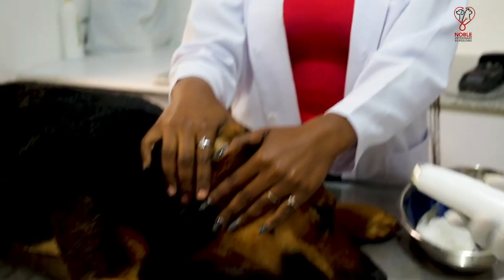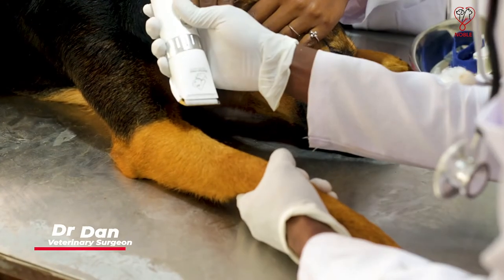The first procedure that we do is shaving the site before we start collection. This aids in removing hair and dirt from the site so that we can also be able to clean well.